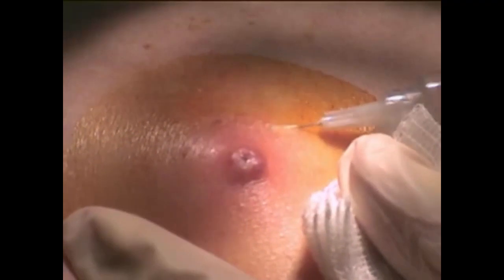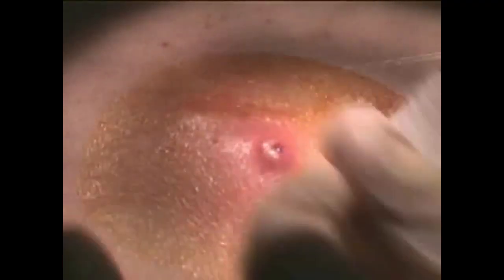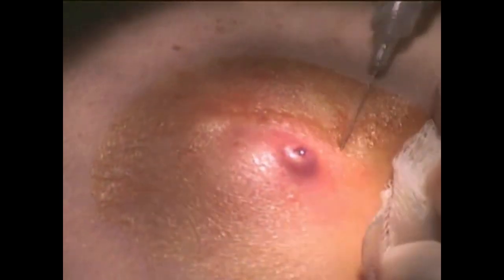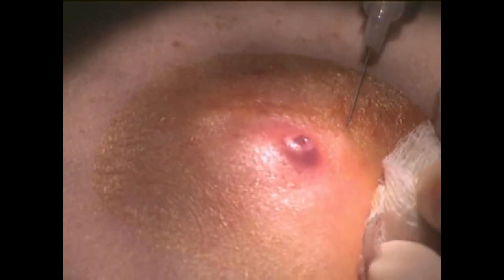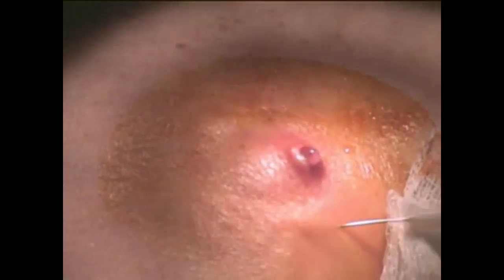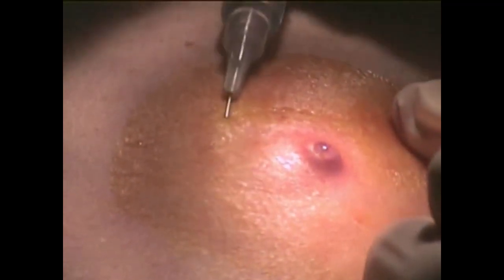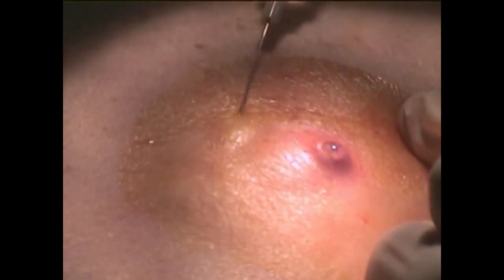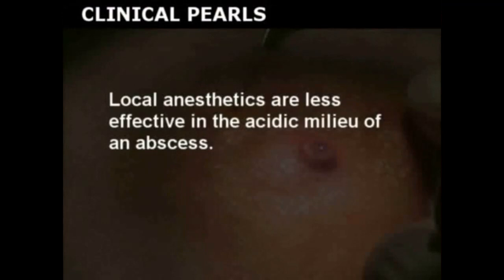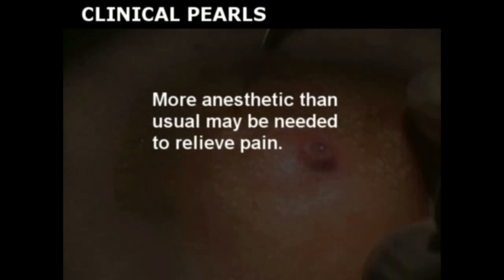Administer a field block with local anesthetic to allow an adequate incision to be made. Avoid infiltration of the abscess cavity. Concentrate on anesthetizing the perimeter of the tissue around the abscess. Local anesthetics are less effective in the acidic milieu of an abscess, so more anesthetic than usual may be needed to relieve pain.